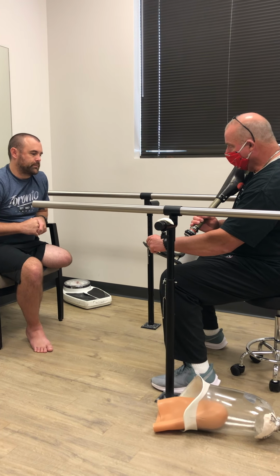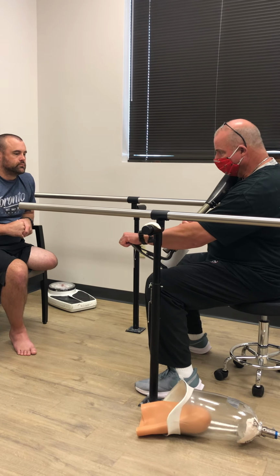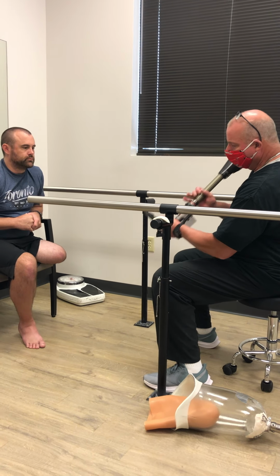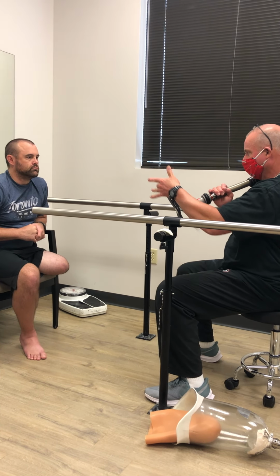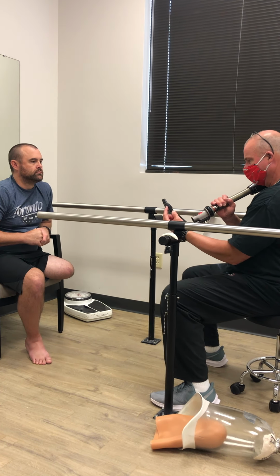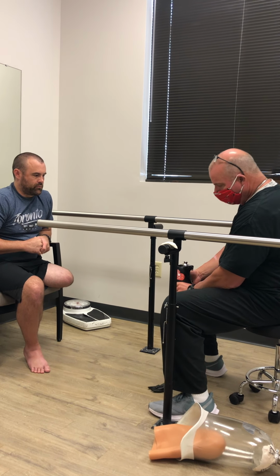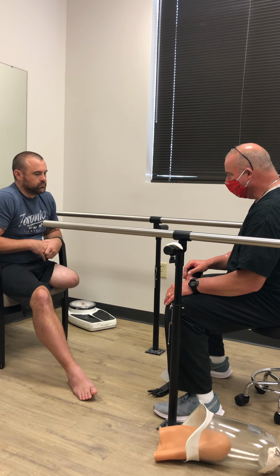Oh, wow, okay. Ottobock are soft foot shells, so these come up into the toes a little better, which I like, because with a lot of normal manufacturers, the toes aren't covered, and even in a shoe, eventually, just from the toe bending over the end, it'll start cutting through the end of the shell. Gotcha. But I get your foot shell and put it on in 10 minutes. Okay. You're out the door.